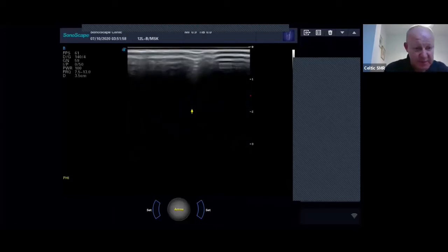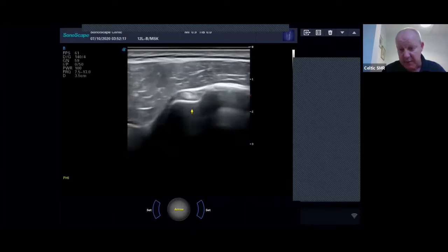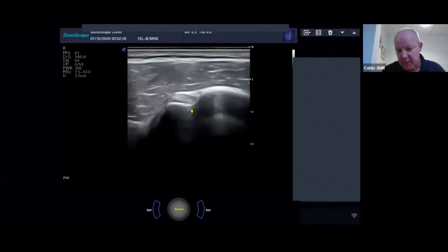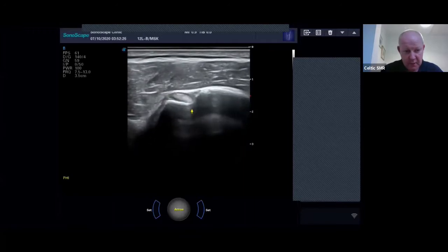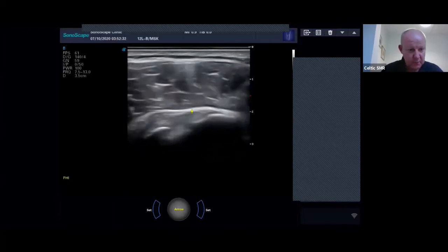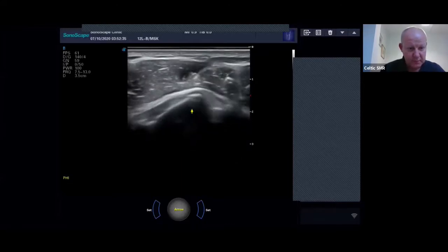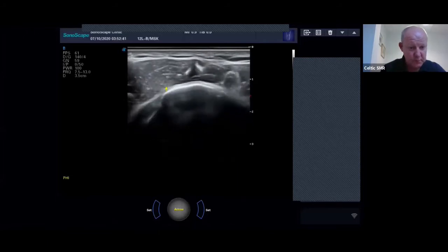Brilliant, thank you. I'm getting quite busy at this end. So a couple of direct questions, if I may, please. Would you do a dynamic test for the biceps long head, or do you just observe? The dynamic test for the medial subluxation, is that what you mean? Yes, yeah, long head subluxation. Yeah, so I do that just to make sure that there's no subluxation medially. It's just an external rotation to see that, and when you see the subscapularis come in, you'll see the biceps tendon subluxing over that way.